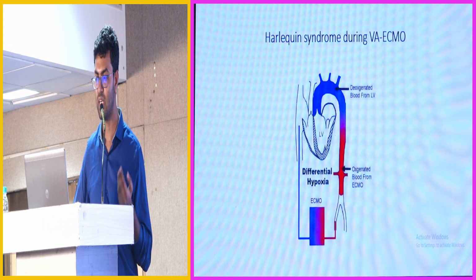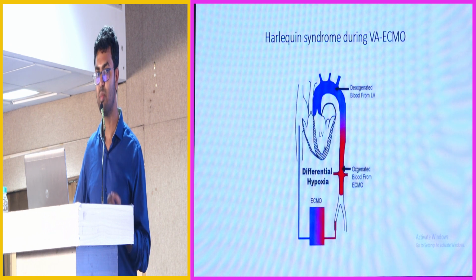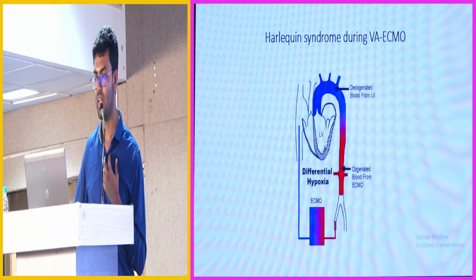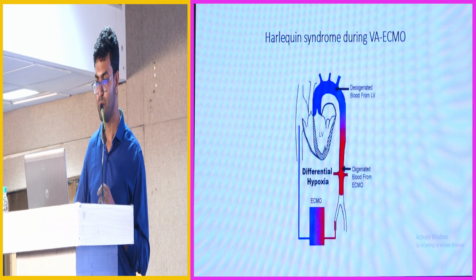You will get a coronary ischemia. If it is a temporary phenomenon, because the coronary arteries are getting deoxygenated blood, it won't recover at all. So how will you know that there is a Harlequin syndrome? First, you have to suspect.